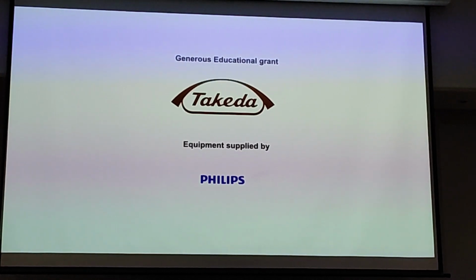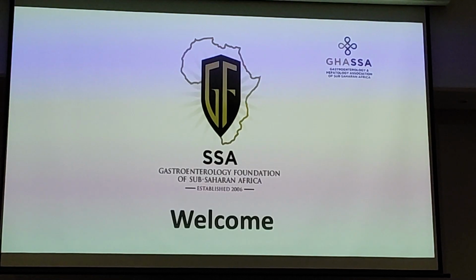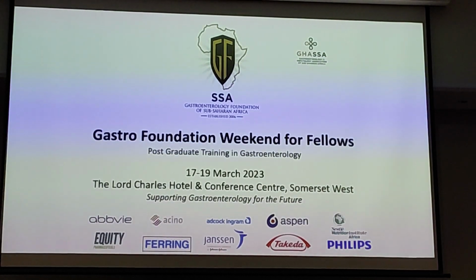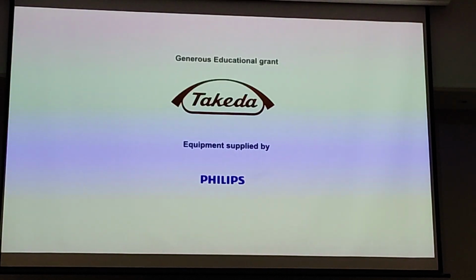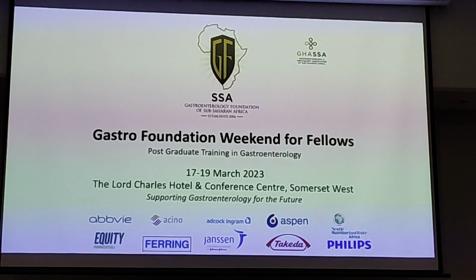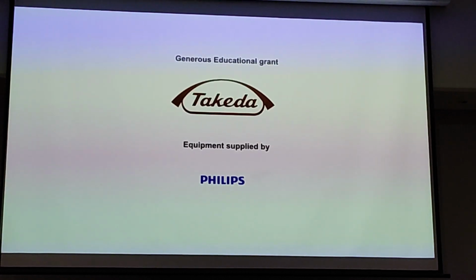It really depends a little bit on who does the validation studies. Usually when gastroenterologists in Europe do the validation studies, the results are a little bit better as compared to radiologists. But I think the results on specificity and sensitivity are always very good, especially in the large bowel and the ileum. Ultrasound is less sensitive in the jejunum, of course. But I think MRI and CT also have their problems in the jejunum.